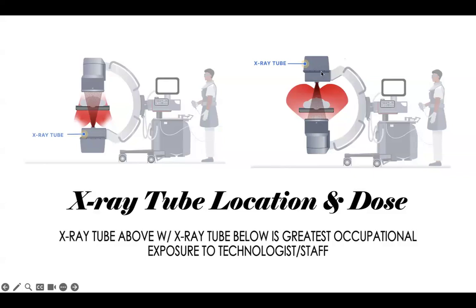And if somebody is doing this, they don't have experience using a C-arm, because you really don't have a reason to put your tube on top and your image intensifier at the bottom. It should always be your X-ray tube on the bottom, image intensifier on the top. Now, like I said, you will maybe have to manipulate the C. You may have to bring the intensifier over, or kind of bring it down some, depending on what's going on, if you need the angle. But you should never, never, never have the X-ray tube above the patient and the image intensifier below the patient.